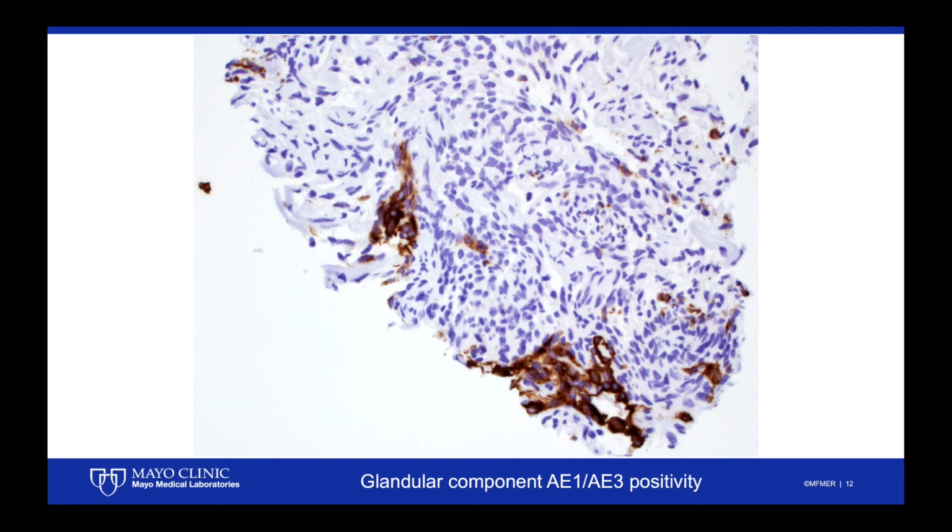Most of the people that responded thought this was synovial sarcoma. Carcinosarcoma would be really unusual in the lung. I think in that setting, the glandular component usually is much more malignant looking. With biphasic synovial sarcomas, the glandular component is really pretty well differentiated.